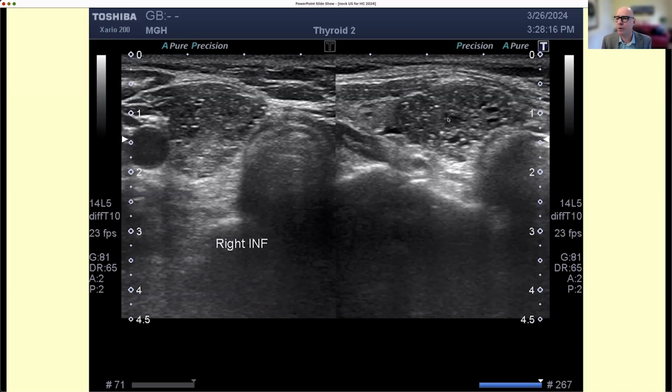Then, I don't know how well this shows on your screen, but you can see that each one of these has a little darker region in front of it. So this could be simply posterior enhancement behind microcysts. I remember when I described posterior enhancement to you, that through fluid the ultrasound machine gets a little discombobulated and generates a lot of bright reflectors. So I do think that these are actually microcysts with some posterior enhancement.